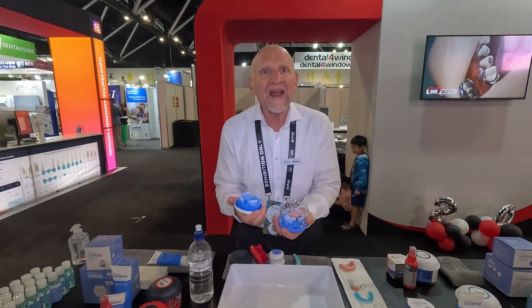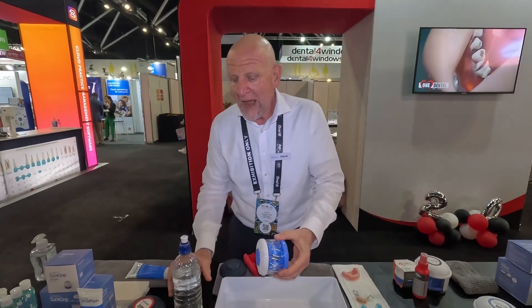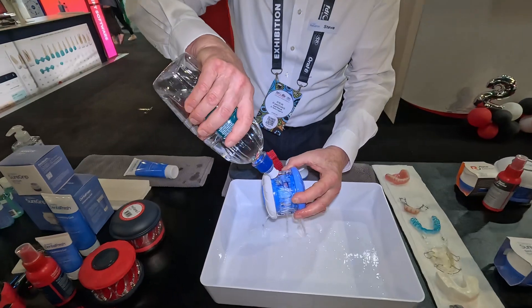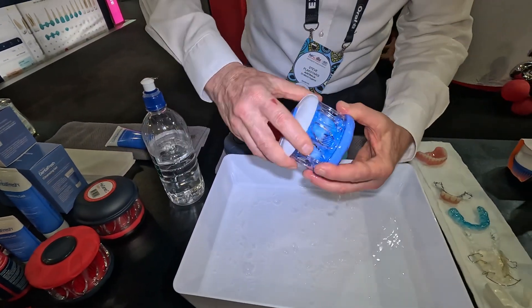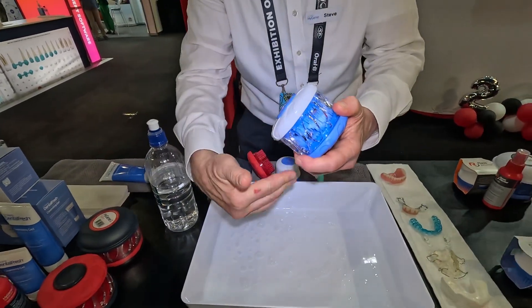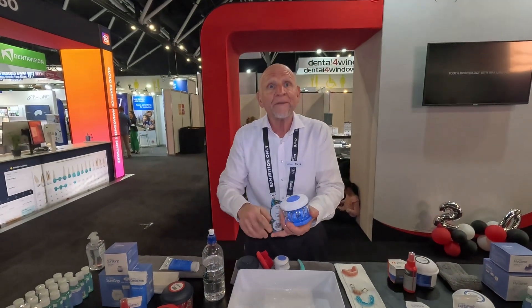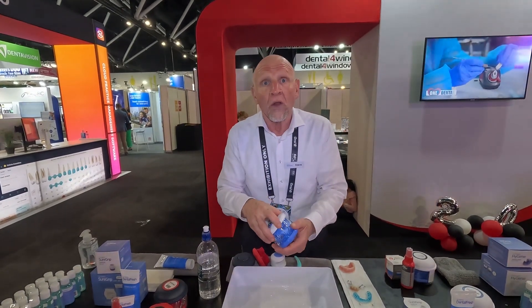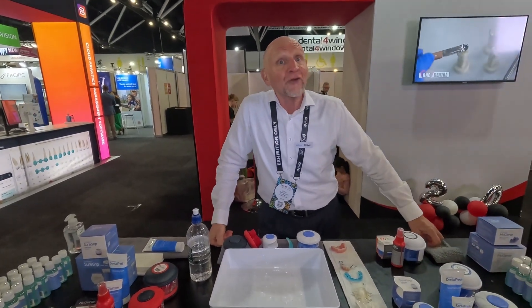All those nasties that collect on that denture, night guard, or orthodontic appliance are now scooped up into the Dental Fresh foam. A gentle flow of water from the tap — while continuing the agitation action — clears the foam, and that denture is now washed, hygienic, healthy, and ready to go back in the mouth, or it can be left in the Hygiene where it will self-drain and air dry.